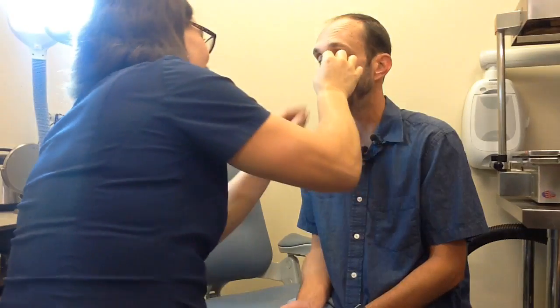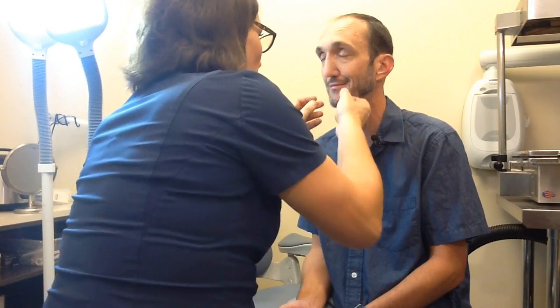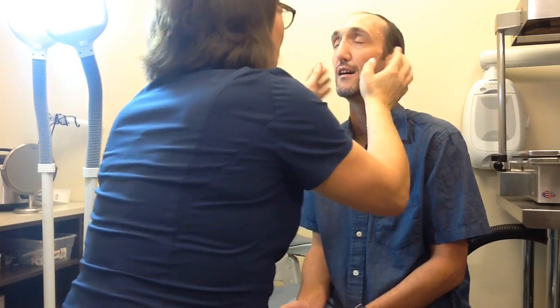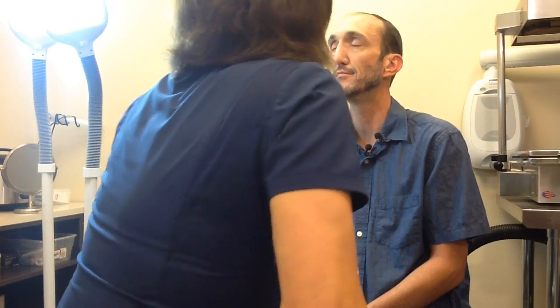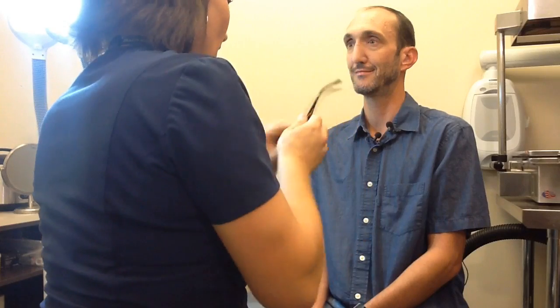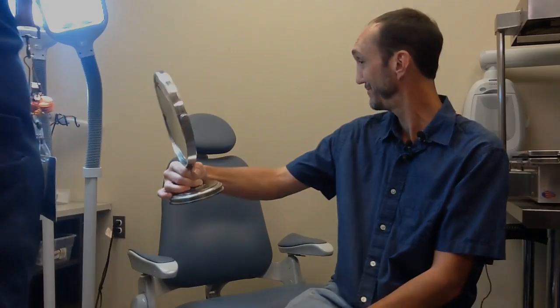That's better. Let's wait for nothing to stick for a minute. Better lift your head for a second. Nice. Awesome. Here, look at me. That's awesome. Let's take a look, hook up in the mirror. Let's go. Looks good, right? Yes, thank you.